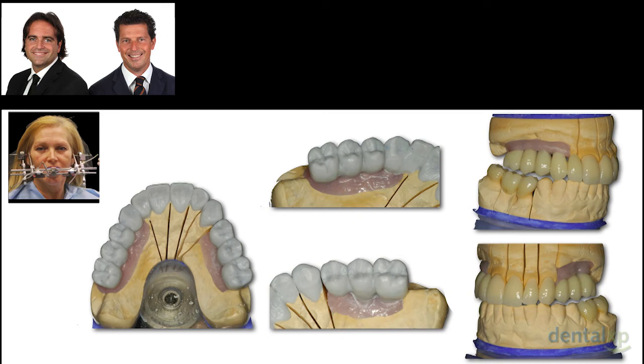We studied together with Luca and Matteo carefully the second provisional restoration as it was the final rehabilitation of the patient, paying attention to all the function and all the occlusal path of this patient, working also with pantographic registration to give them the most information available, in order to give them the possibility to build a provisional restoration that was basically perfect.